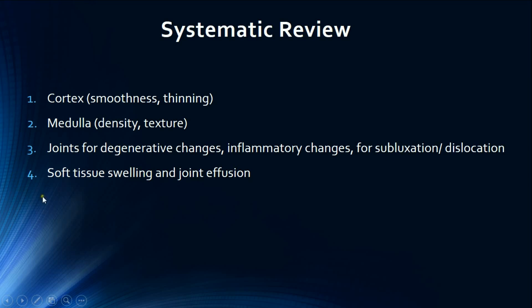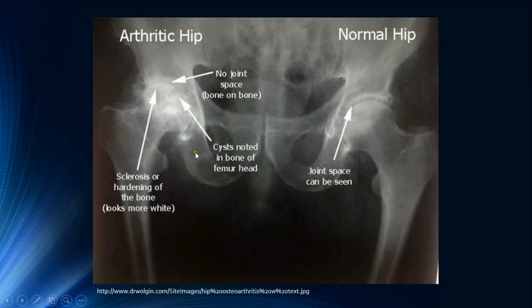Here we have a good example of osteoarthritis of the right hip. We can see loss of the joint space, subchondral sclerosis which appears as increased opacity, and subchondral cysts which appear as lucencies, as we can see here.